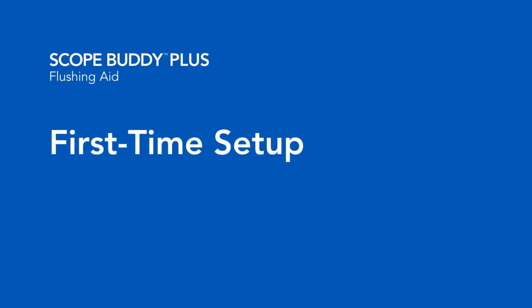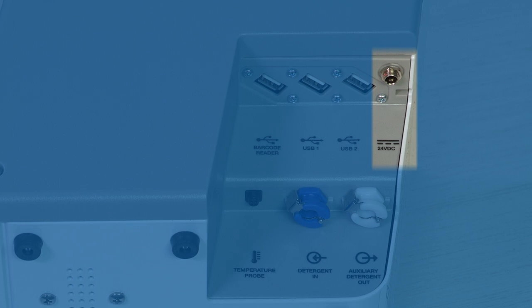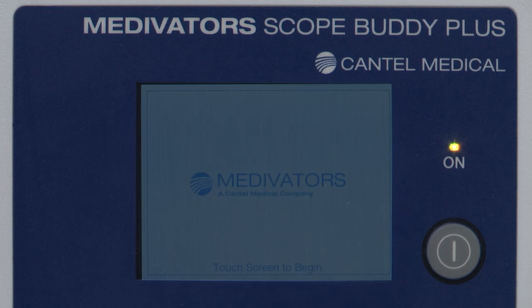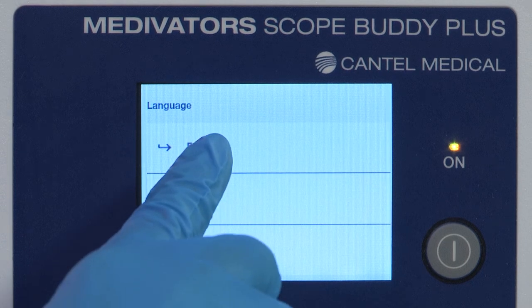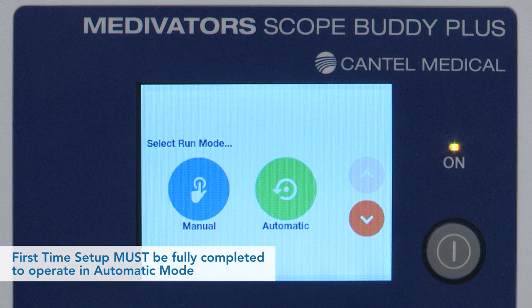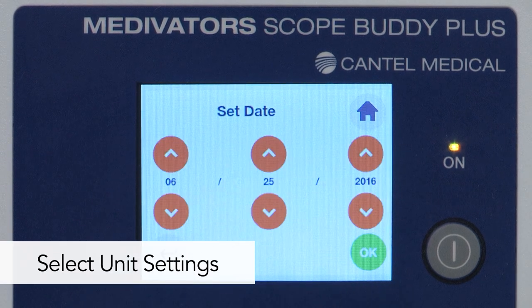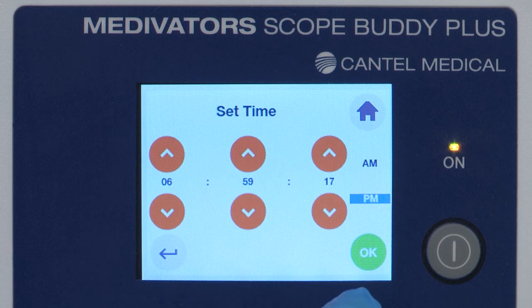To perform first-time setup on the Scope Buddy Plus Flushing Aid: connect the power cord to the side of the device and to an AC outlet; connect the barcode scanner to the USB port; turn the unit on by depressing the power button until the on light illuminates. When prompted, touch the screen firmly to begin. Select the desired language, then select Automatic in the Select Run Mode. Note that first-time setup must be fully completed to operate in Automatic mode. Select the desired date format, press OK to confirm, and set the date using the arrows. Select the time format and set the time using the arrows.